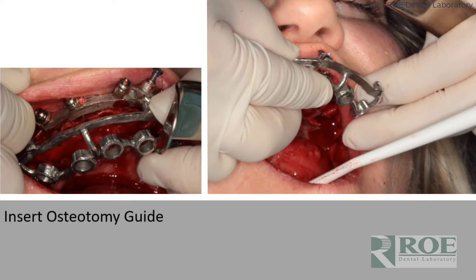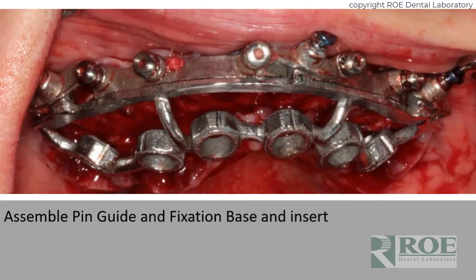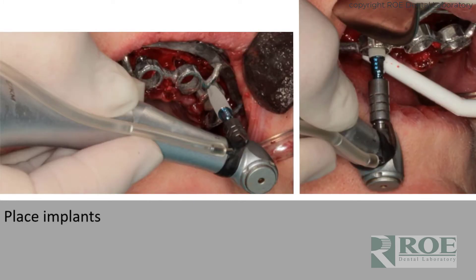Then the osteotomy guide is seated. The osteotomy guide comes in a few different variations depending on the guided kit and how far along we are with our development. There will be two nubs or perhaps six depending on the guided kit you're using. These indicate indexing and rotating of the implants according to the specific implant, implant mount, and guided kit. In this case these are angled, with a hex and a mark for the rotation. Seat the osteotomy guide and go through the progression with the fully guided or partially guided kit — it must be a guided kit, not a regular kit. The spoons, hubs, and tools will be used to make the osteotomies.